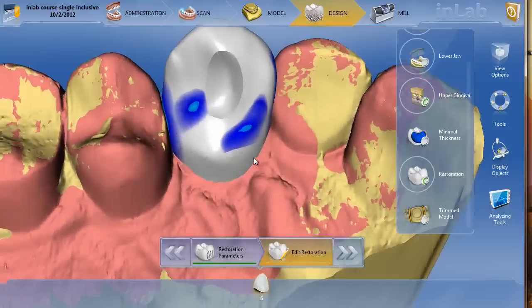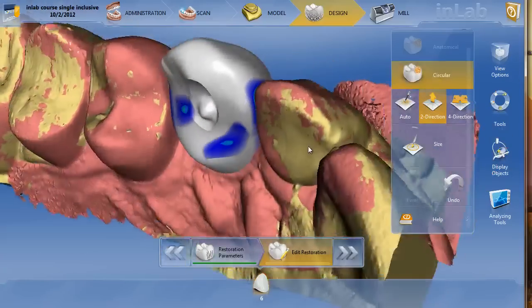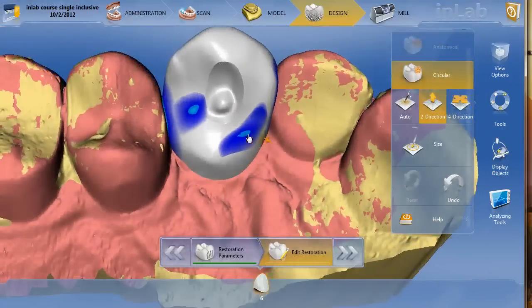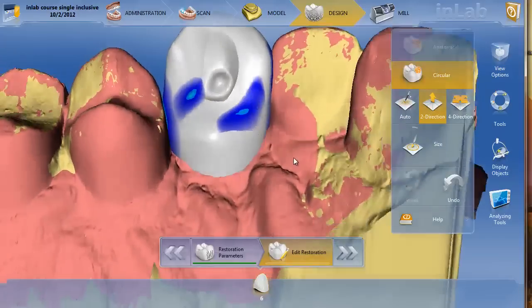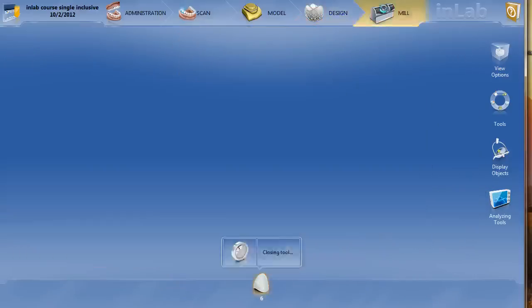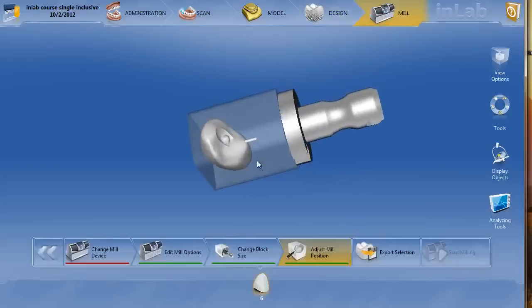If you want to make it a little bit deeper, you can take your circular shape tool, go right in the middle, and just move it down a little bit. That's all you really need to do — you can actually get it pretty close just with that reduction tool. When you make that nice outline, it's going to confine the circular shape tool to within that hole, so you don't really have to worry about it too much. Once you're done with that, we'll go to the mill preview and you're all set to mill your screw retain crown.